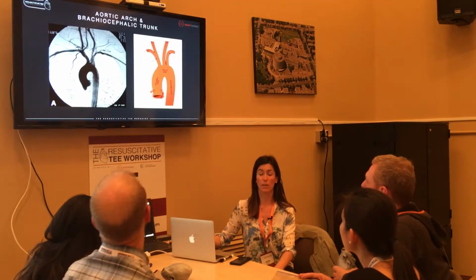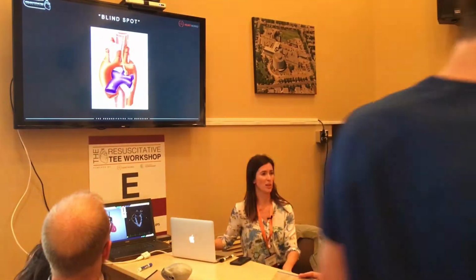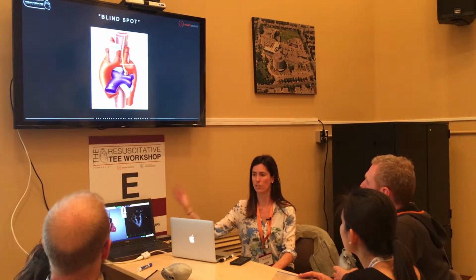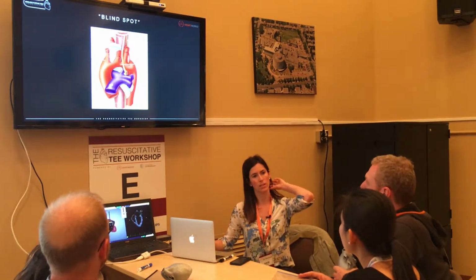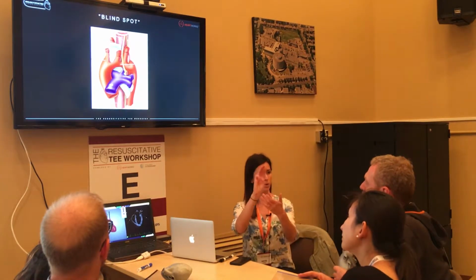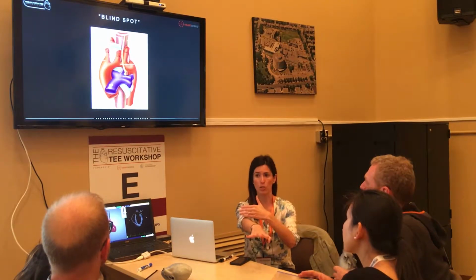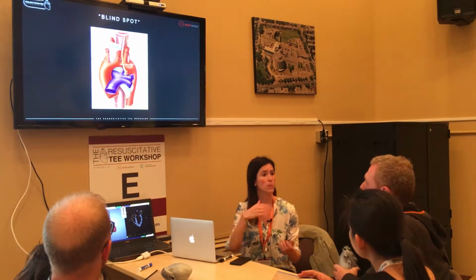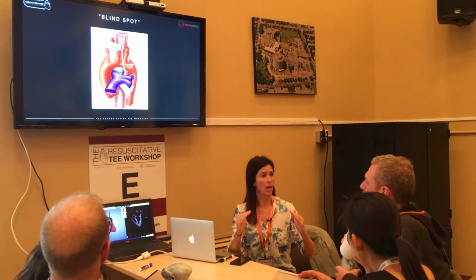So starting out at that brachiocephalic trunk, there is something that can cause this problem, and that is the trachea. What's inside the trachea? Air. And what does air do to ultrasound waves? It scatters them. So there's a point at which those 3 branches enter the aortic arch and where that pulmonic trunk comes underneath, on a real person, we're going to lose that image because of air scatter, because of the location of the trachea and the bronchi.